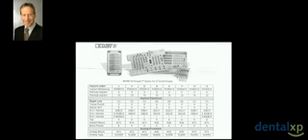And you get a cheat sheet. Every one of these systems comes with the cliff notes. And these cliff notes, does anybody know what cliff notes are? I see such a young audience here. They probably don't have it in a book form anymore. It's probably on a PDA. But essentially, you get all this stuff. And it's your dental assistant who's interpreting all this information, assembling everything for the time of surgery, but it all happened before that day.